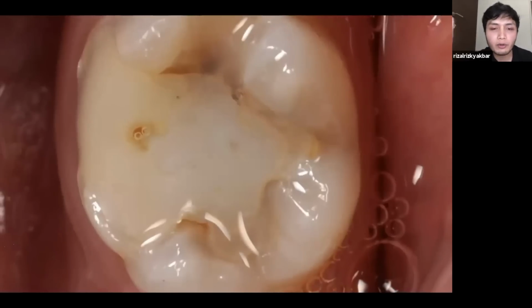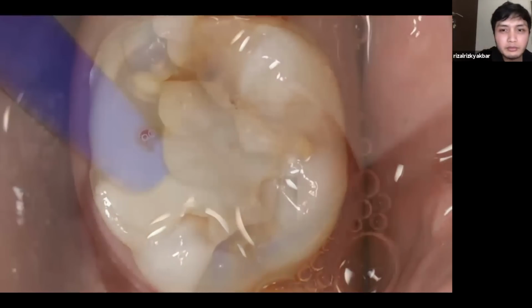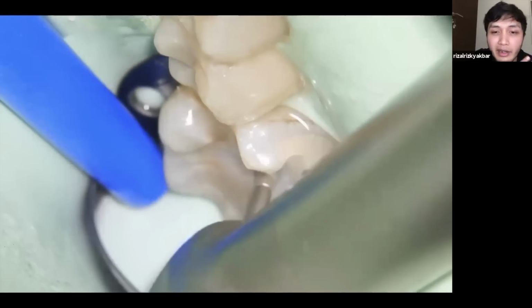Okay, this is the last case for me. This is a class 2 restoration.